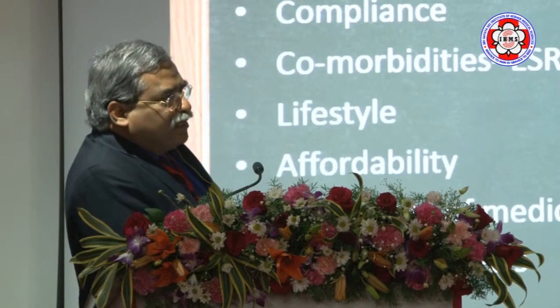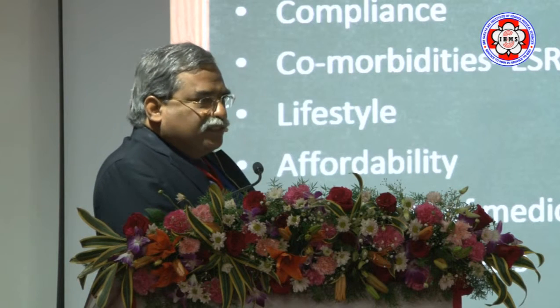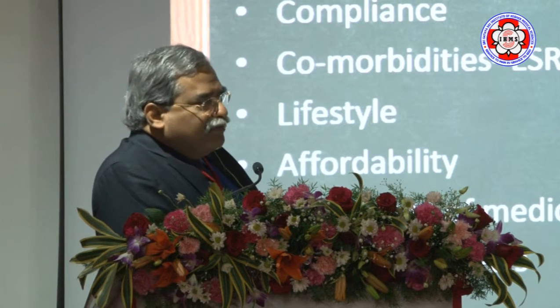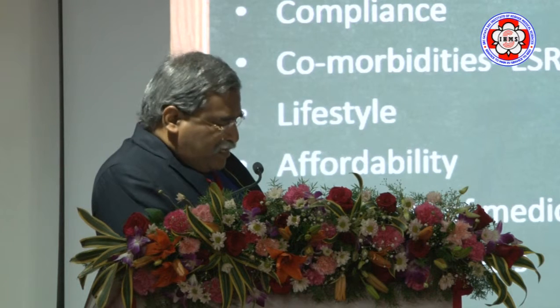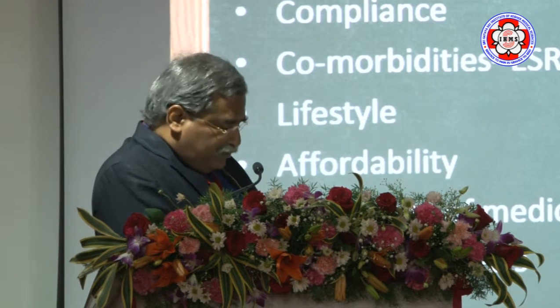And the technical aspect, of course: we need to look at the anatomical situation of the valve and other things, which valve will suit. In a very, very small LV, putting a high profile valve may be a problem. So you need to look at all the technical aspects of replacement also.